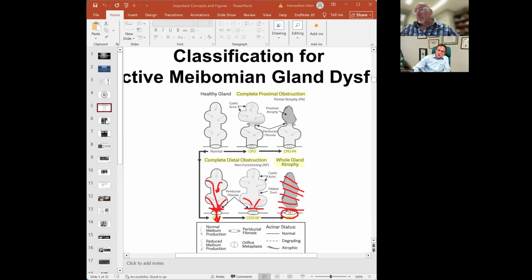And I find that is the cause of over 90% of glands and lids with MGD have this fixed resistance, over 90%. You can have thickened oil, absolutely, but again, that thickened oil as a cause of obstruction is relatively less frequent. Again, 90% of glands in lids with MGD have periductal fibrosis. Therefore, I recommend probing in all patients because it's ubiquitous.